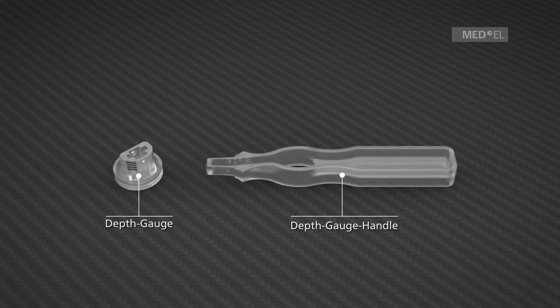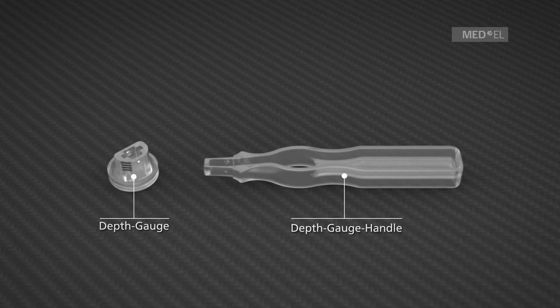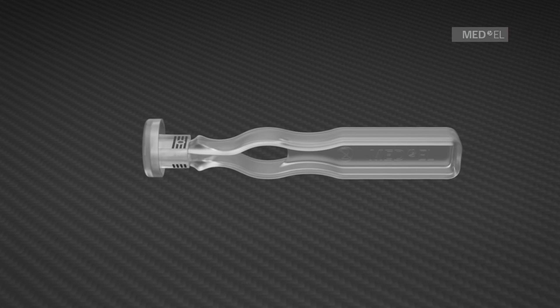The depth gauge handle is assembled with the depth gauge to provide easier handling. Press the lower part of the handle together to assemble or disassemble the depth gauge handle and the depth gauge.